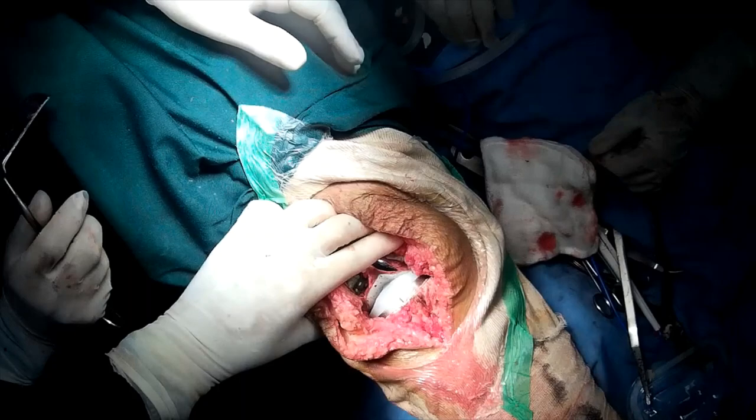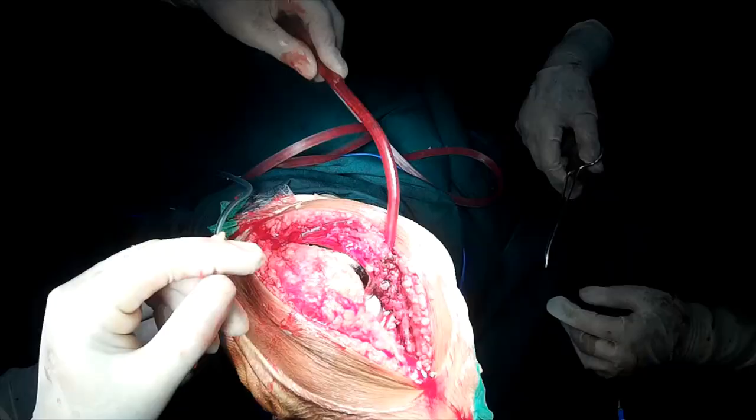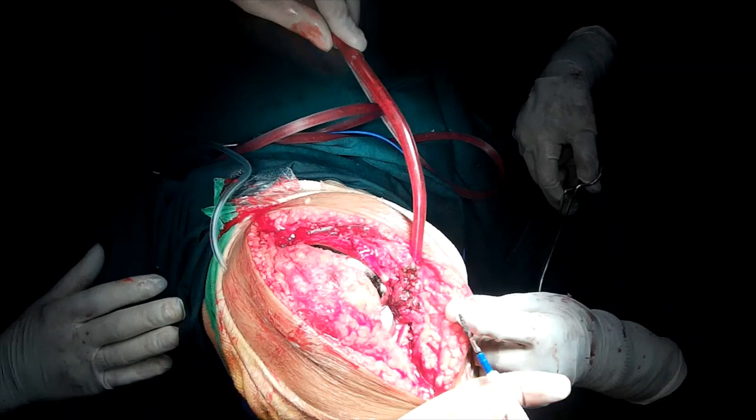Now we deflate the tourniquet and achieve the hemostasis and give thorough wash to the wound, and then we proceed towards the arthrotomy closure.